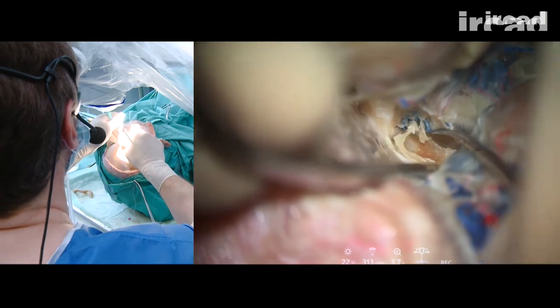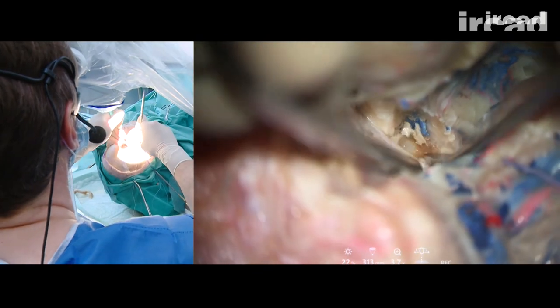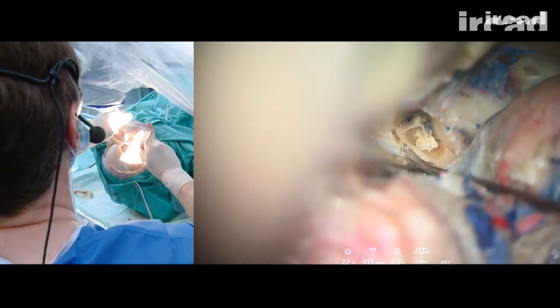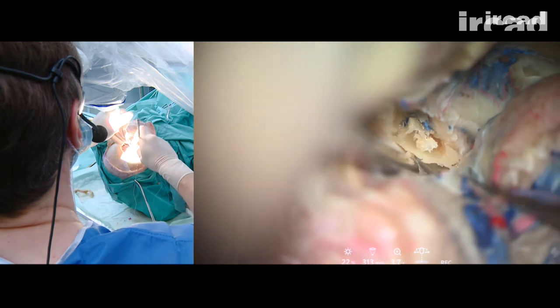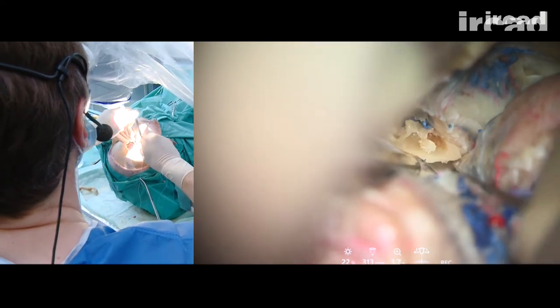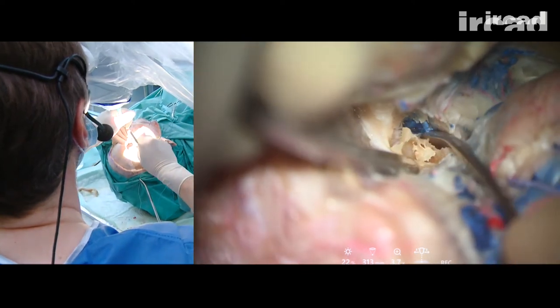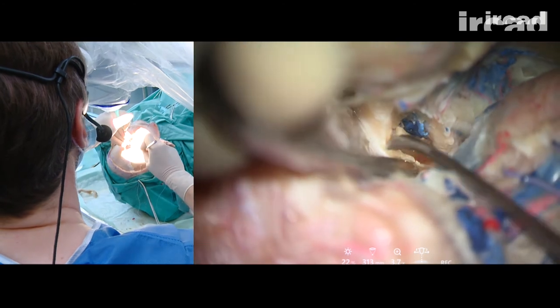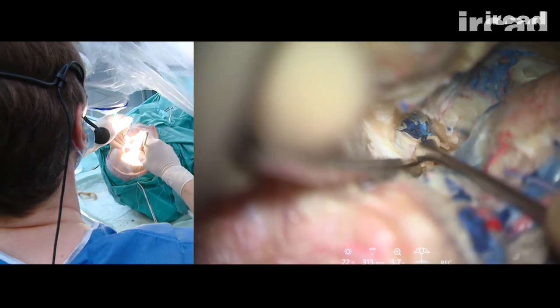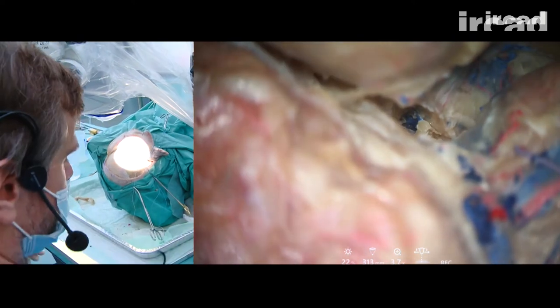So once the tip of the clinoid is well mobilized, you should not pull on it to take it out, because again, there is sometimes a spine of bone behind the carotid, so you should free it progressively from its dural attachment. And it should come out by itself without too much traction on it. It's better to do it this way.